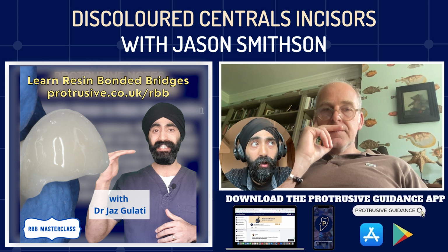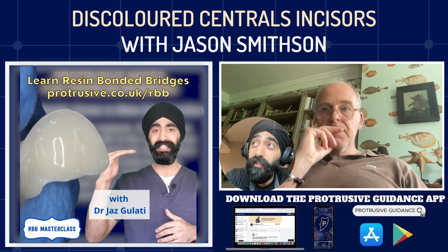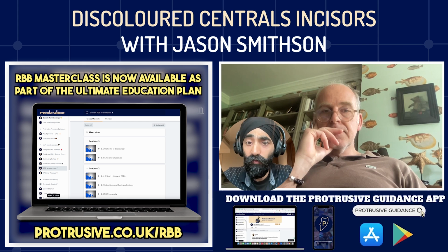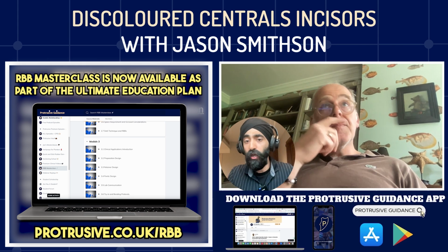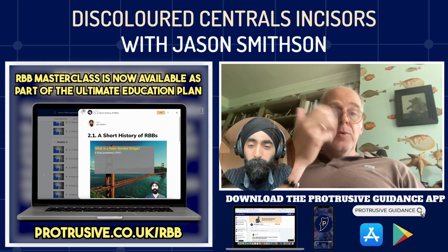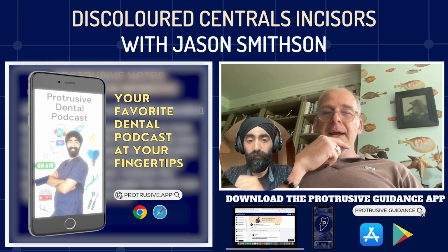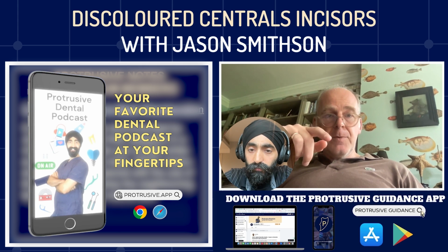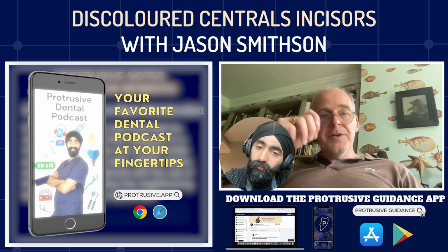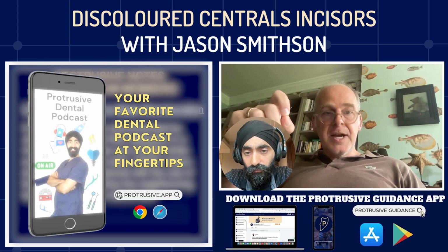So I've seen pink opaque by Cosmodent, and I've used Ivoclar's white opaque in the past as well. Do you have a preference in terms of which flowable opaque works well in certain scenarios? Yeah, a lot of companies make good ones. Tokuyama make a good one. Kerr make a good one. I kind of like the Cosmodent ones, and the reason is that it's one of the few companies that actually make the opaquer in a Vita shade.